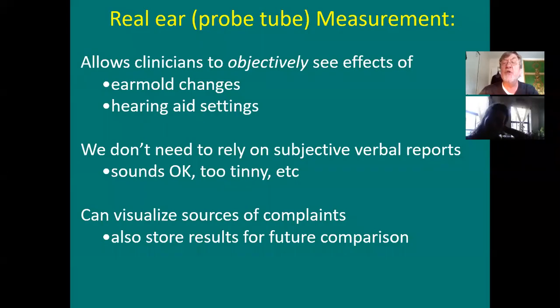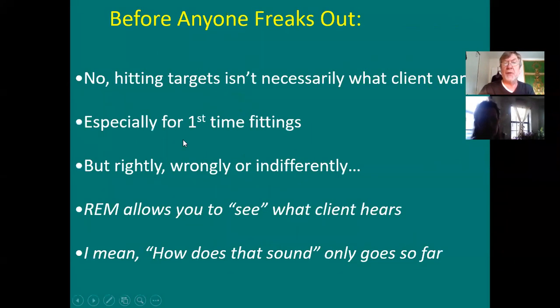I'll share a screen here and we'll look at the PowerPoint here. The beauty of Real Ear is it allows you to objectively see what's happening. Ear mold changes, hearing aid settings, and as Tina said, changing the fitting formula. You can see the difference. The beauty of Real Ear is it allows you to see what the client is hearing. And you no longer have to sit there relying on subjective verbal reports. So sounds okay or it's tinny. You can actually see what's going down, which is really cool. And here's a point too.